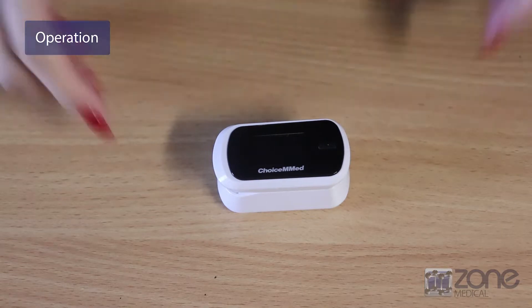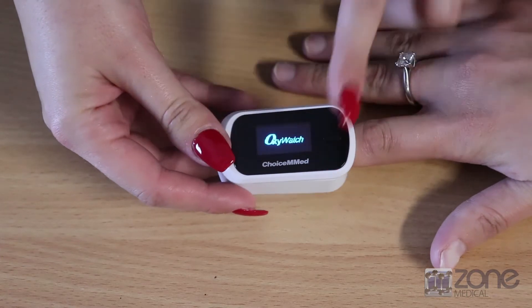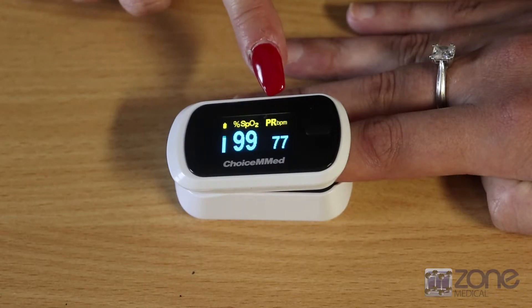To use the pulse oximeter, place it on a patient's finger and press the on button. It will take around 10 seconds for the display to show up and for the correct readings to display. The SpO2 and the pulse rate will display.